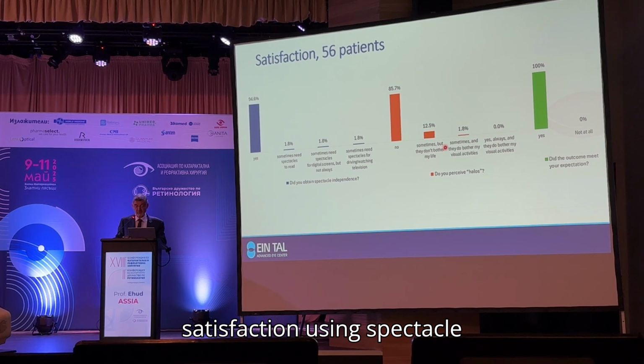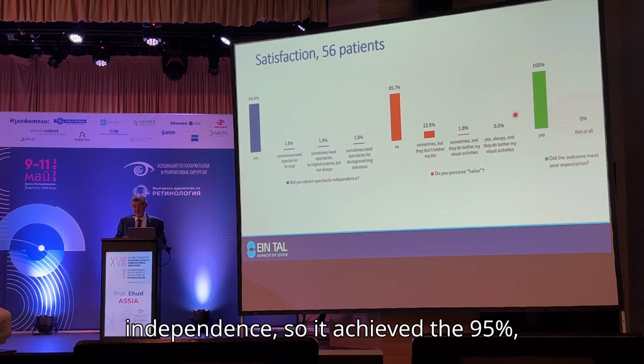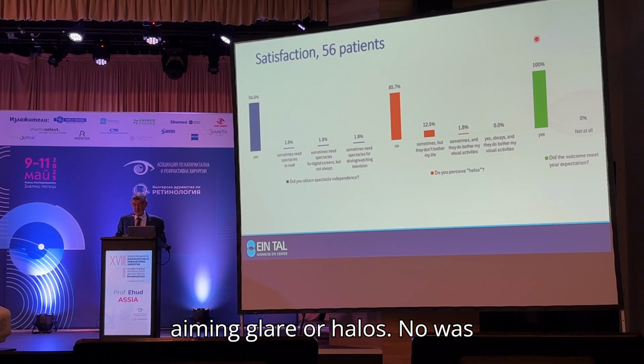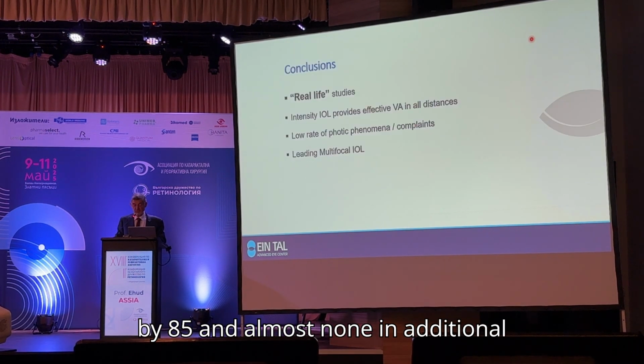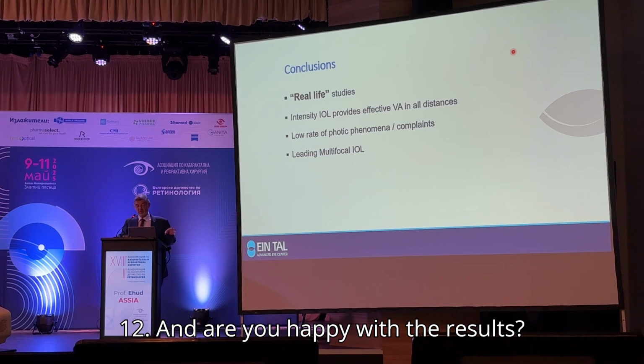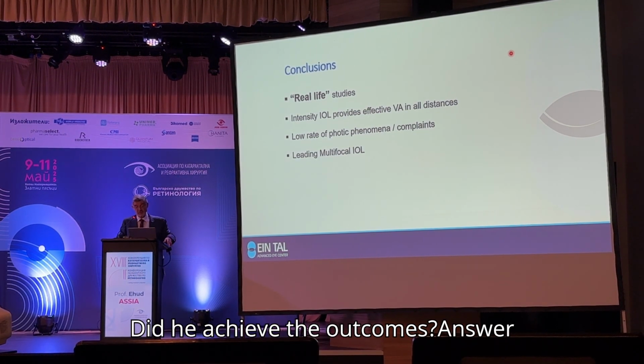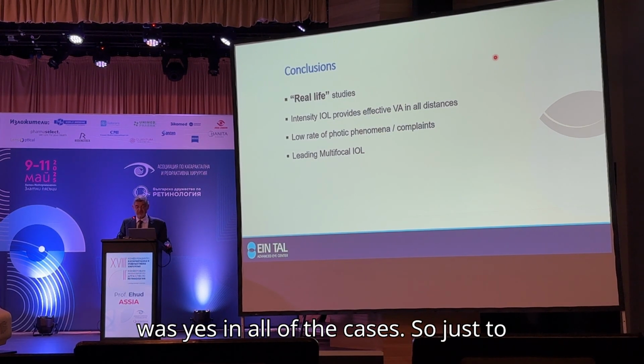Satisfaction using spectacle independence, it achieved 95%. Having glare or halos, no was 85 and almost none an additional 12. And are you happy with the results? Did you achieve the outcomes? The answer was yes in all of the cases.